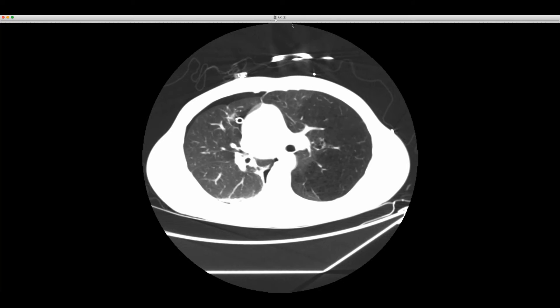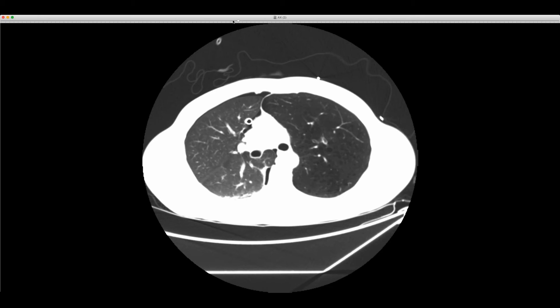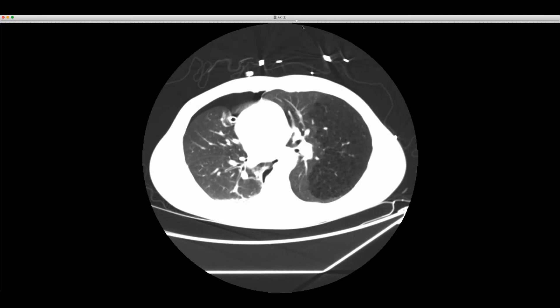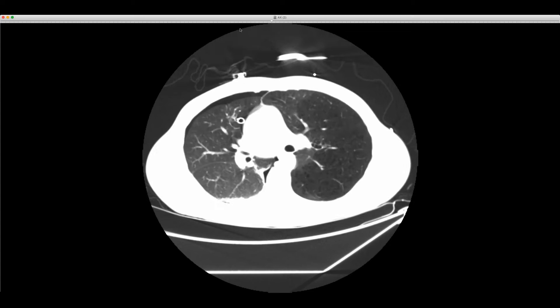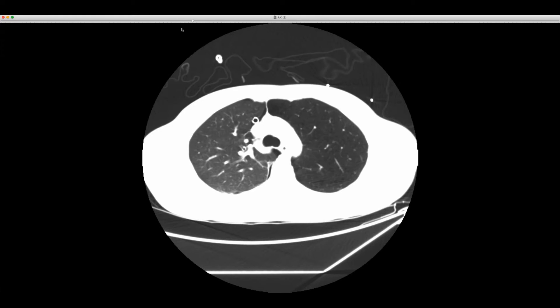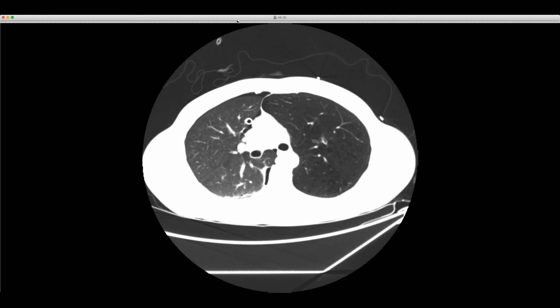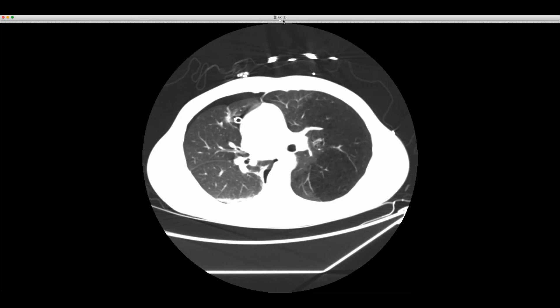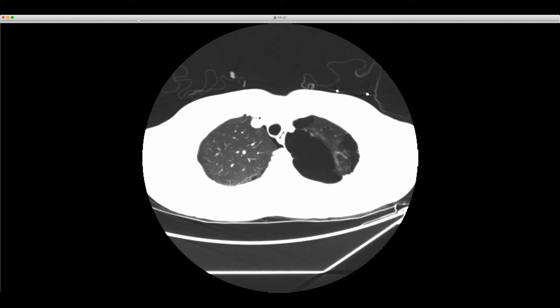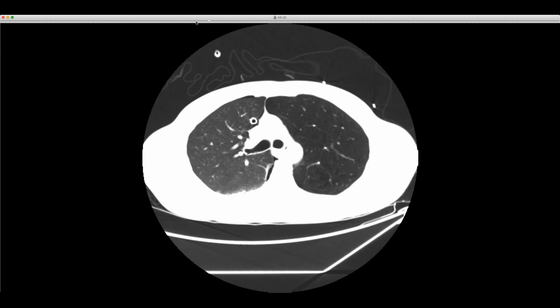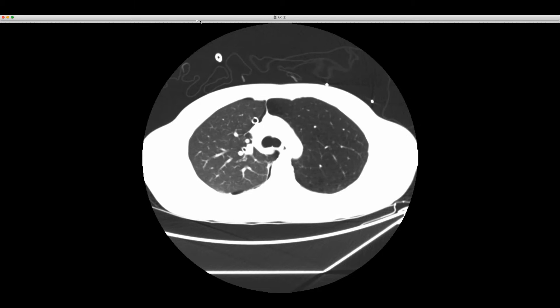Looking centrally, the bronchi are filled with debris and can't be connected with the left main bronchus — the left upper bronchus appears atretic. There's geographic low attenuation throughout the affected lung. This is presumably a case of bronchial atresia onto which smoking-related emphysema is superimposed. However, one discussant notes that the disorganized cystic lung looks more like a giant CPAM, since the other lung looks too normal.